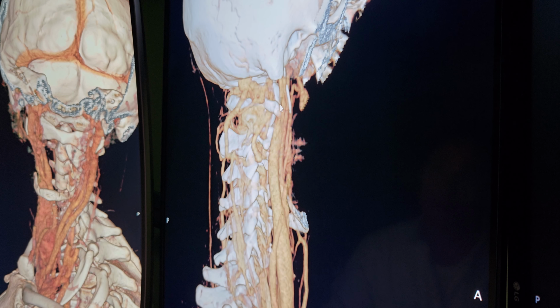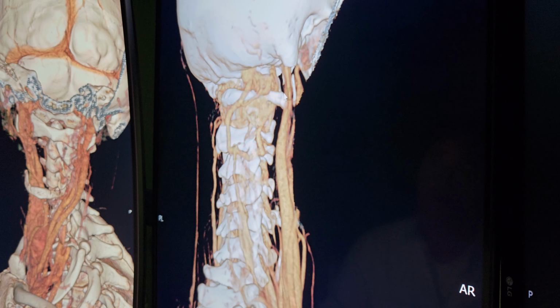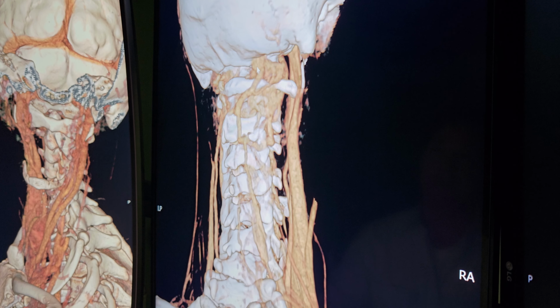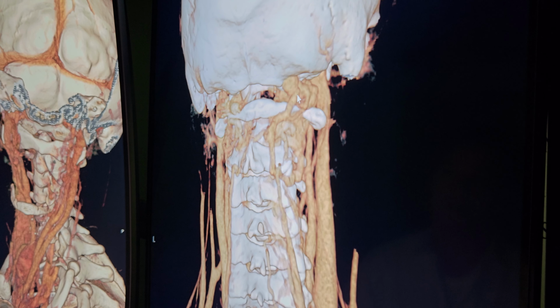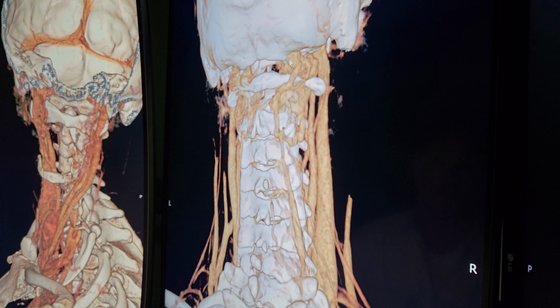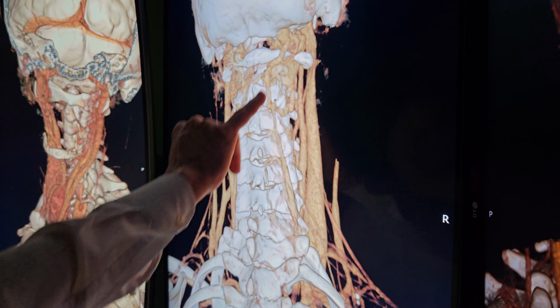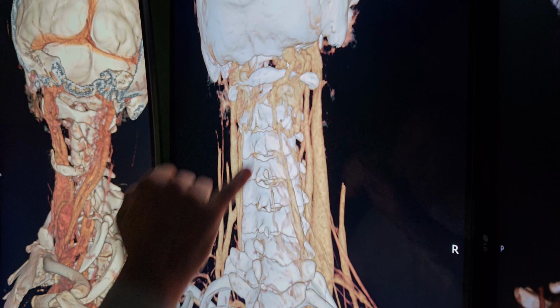This jugular vein is indeed compressed, and there's not a lot of venous congestion, venous drainage. You can see all the varicose veins, all the veins that are backed up and dilated through here. Now, when we ran the arterial phase on you, one of the first things that we noticed, long story short, is that this side seemed to be inflated.